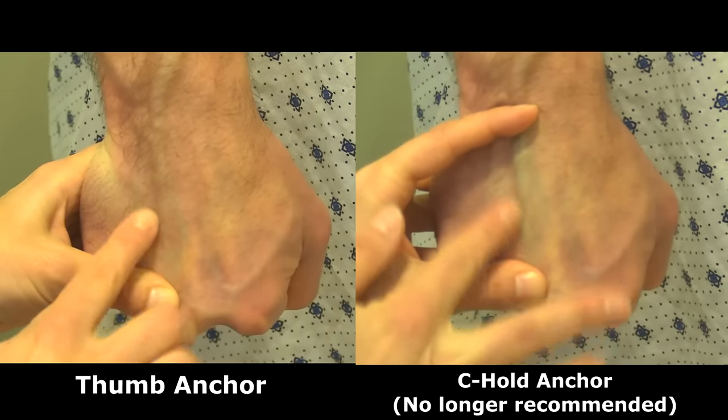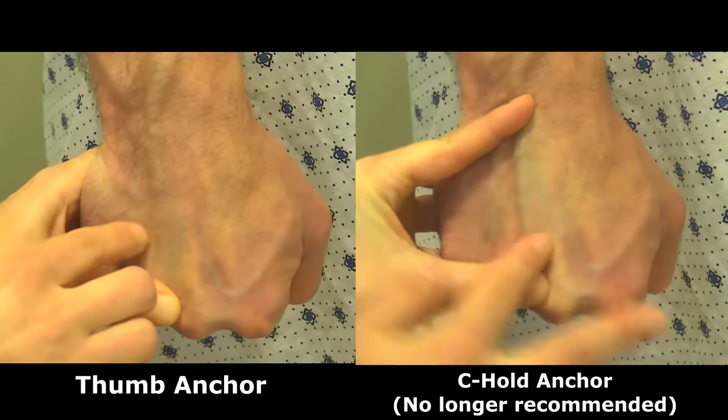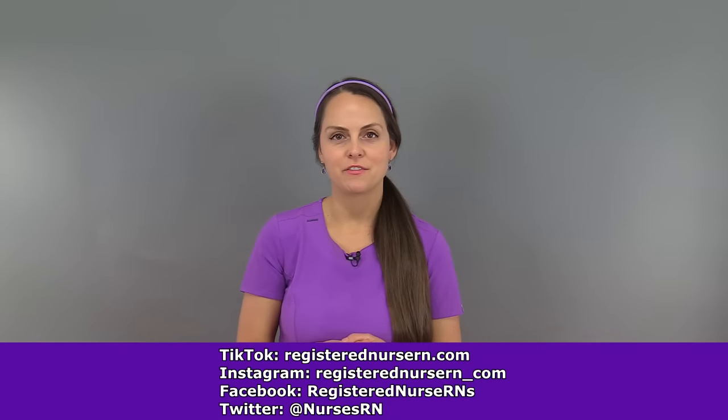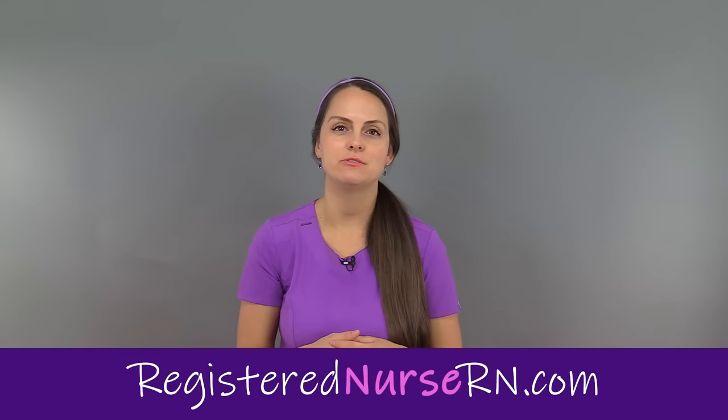As a quick comparison, you can see how both methods can anchor the vein in place. However, the thumb anchoring technique is generally considered safer since the thumb is under and not above the needle. That wraps up this video on how to anchor veins. If you'd like to watch more videos on how to start IVs and other IV tips, you can access the link in the YouTube description below.